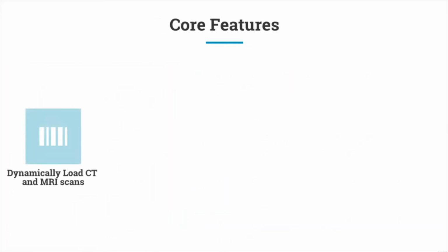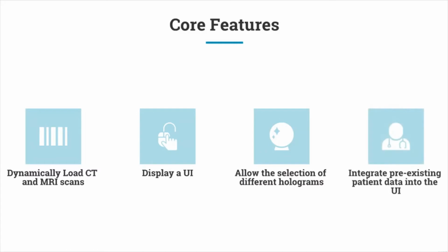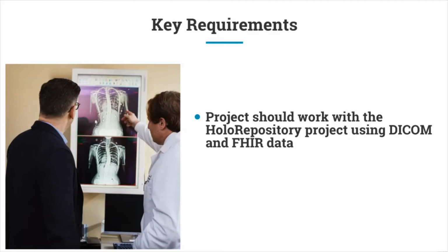The core features of the project are to be able to dynamically load CT scans and holograms and project them onto a screen using pico projectors, to display a UI, to allow the selection of different holograms, and to integrate pre-existing patient data into the UI. It is imperative that the project works directly with the Holo repository project, which can provide us with patient holograms and data from an endpoint and is secured with FHIR.